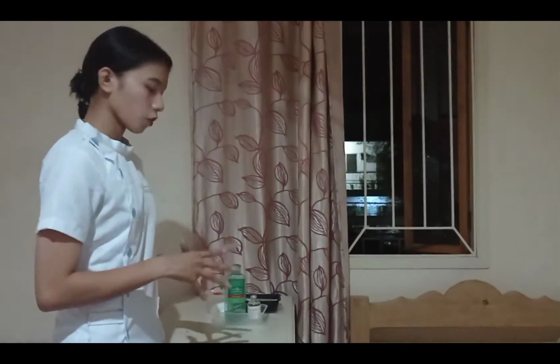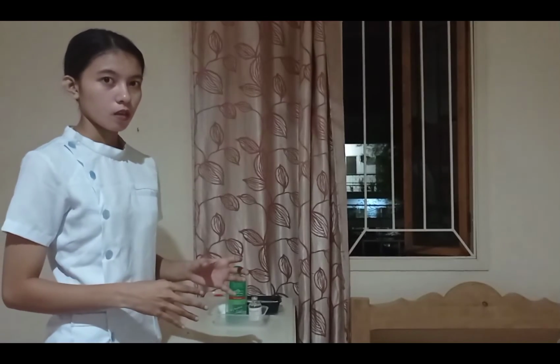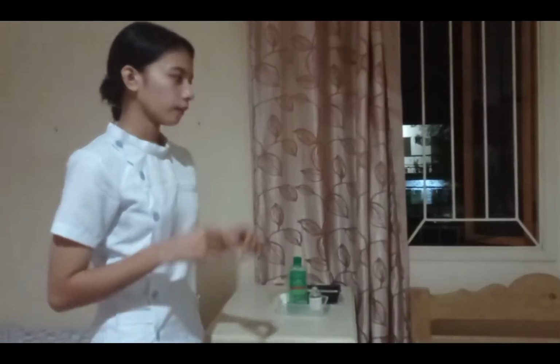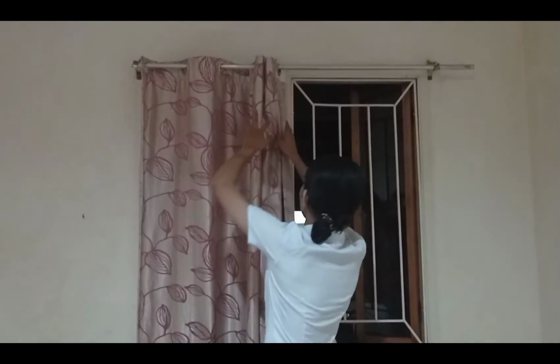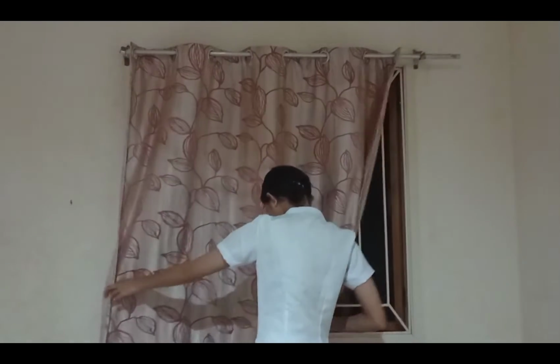Then we prepare the table. The next is to prepare the intramuscular vaccine and a special syringe to be used, with a dose of 0.5 ml. Supplies to be used. Then we provide privacy to the patient by draping the curtains and closing the doors.